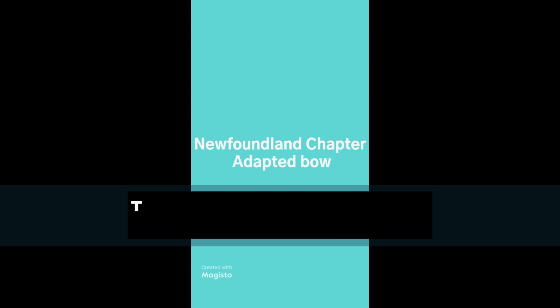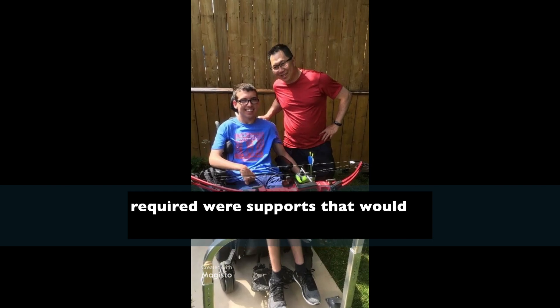This product was done by the Newfoundland chapter. What was required was supports that would enable the client to be able to do his archery.